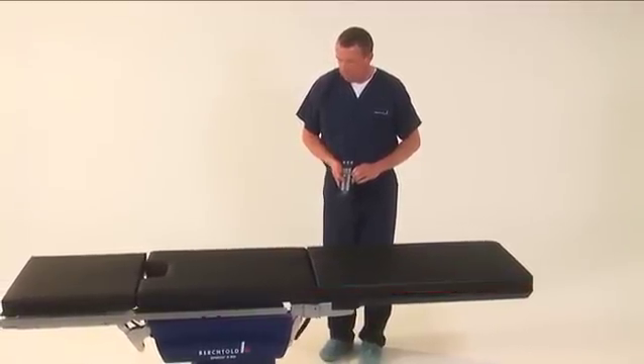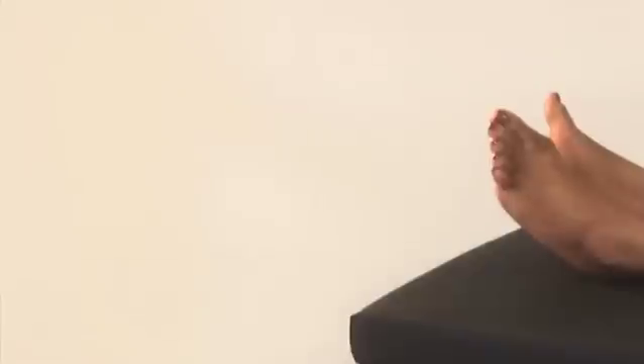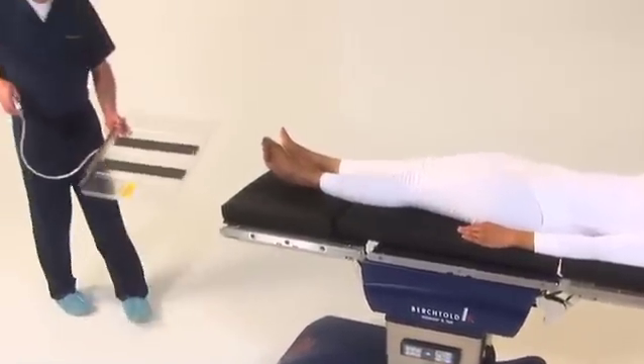This extension replaces the head and back section. When preparing for imaging, place the film inside the X-ray cassette holder. The cassette holder can be introduced at the head or leg section of the table.